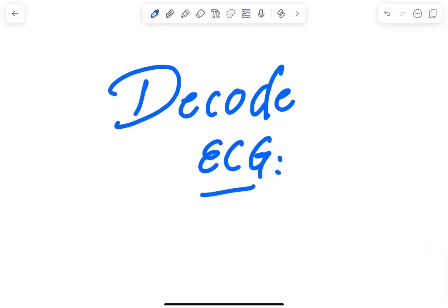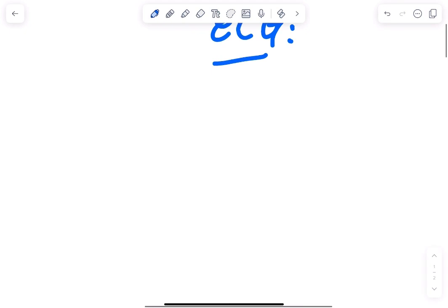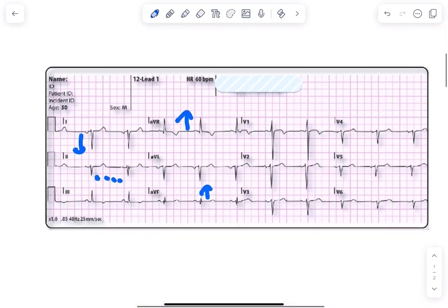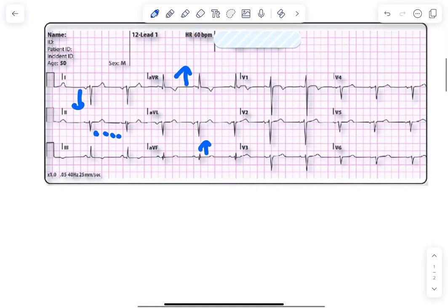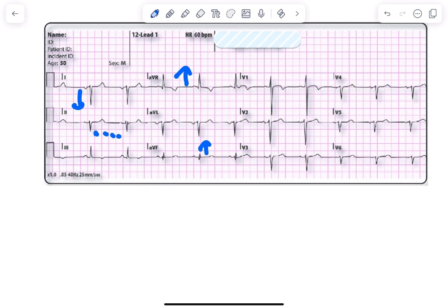Hello friends, let's decode the ECG sent by one of my friends. Let's look at the rhythm first. The rhythm looks like sinus rhythm and there are around four and a half to five boxes, so the rate comes to be around 60 beats per minute.